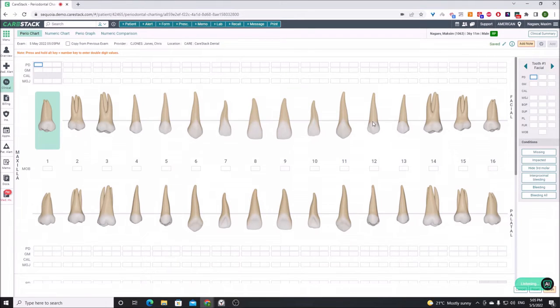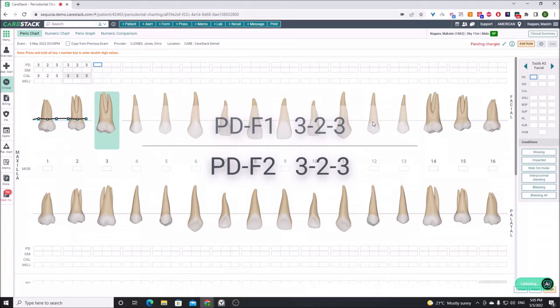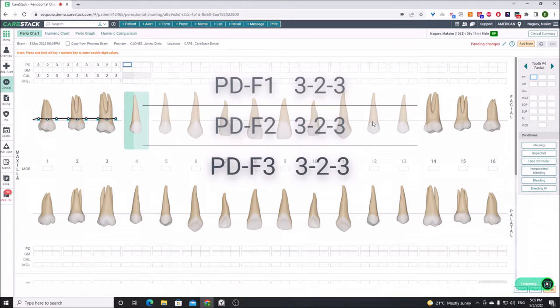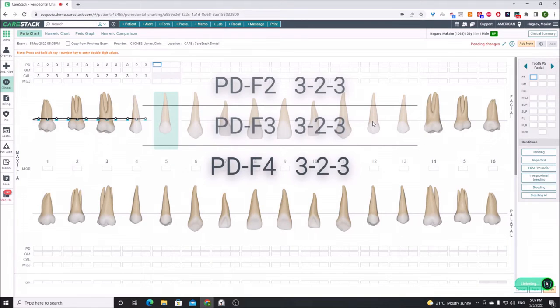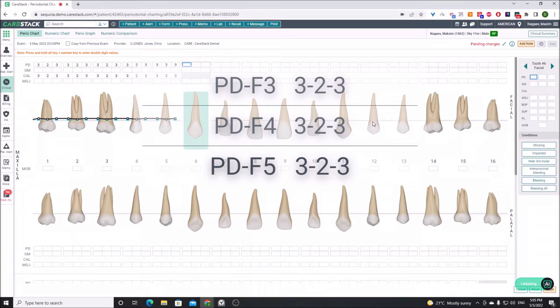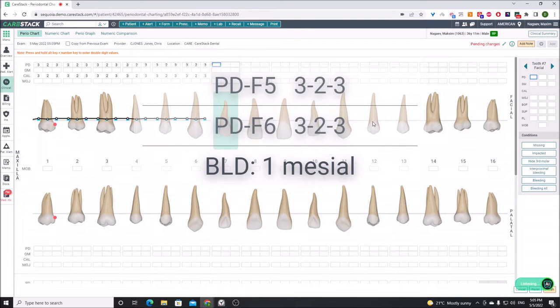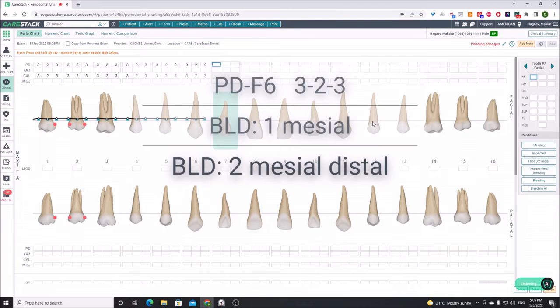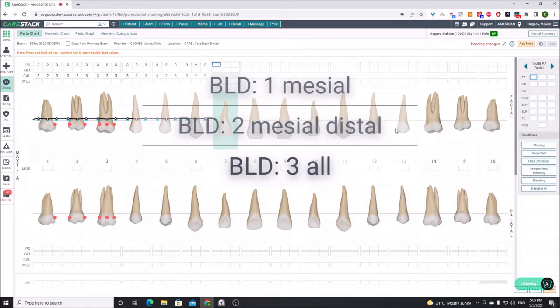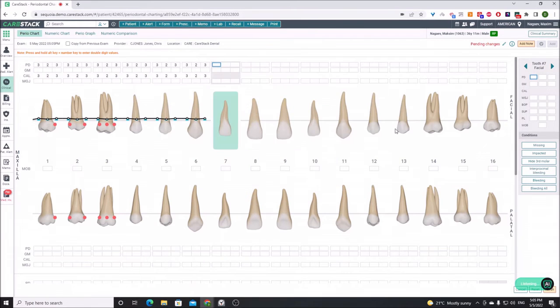3-2-3, 3-2-3, 3-2-3. Bleeding 1 mesial. Bleeding 2 mesial and distal. Bleeding 3 all. Mobility, class 1, tooth number 1.